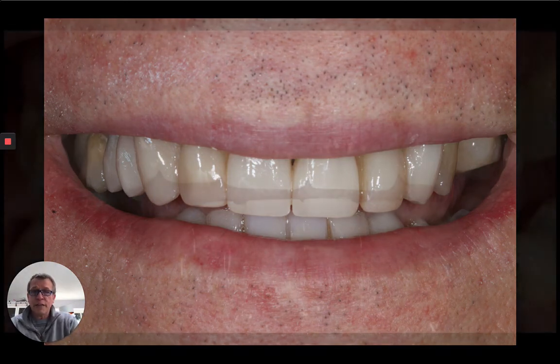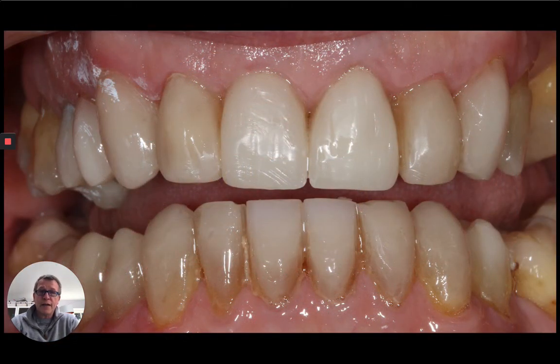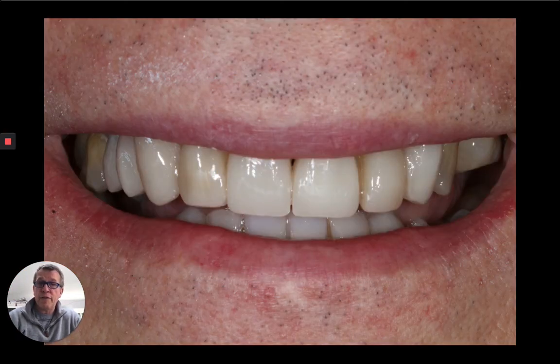So that's how he looked. There are the lowers, as you can see. Just still, you can see his natural tooth underneath. Probably some little bits that I could tidy up for him, but I think he looks pretty decent, and all of our functional and aesthetic goals are there. I say it's not the best case, but I think it does demonstrate how you can use the system that I'm suggesting to you to make these things economical, productive, efficient, and to make sure that we've engaged really, really well with the patient.